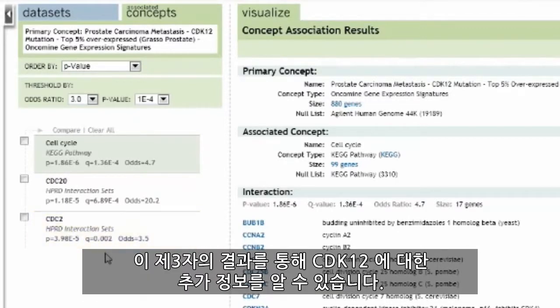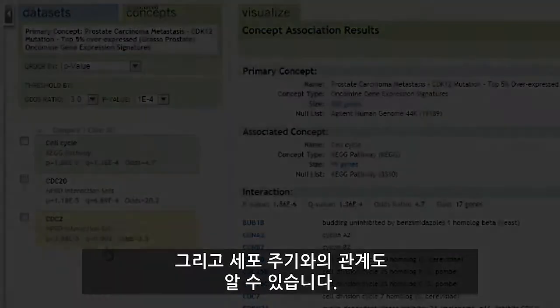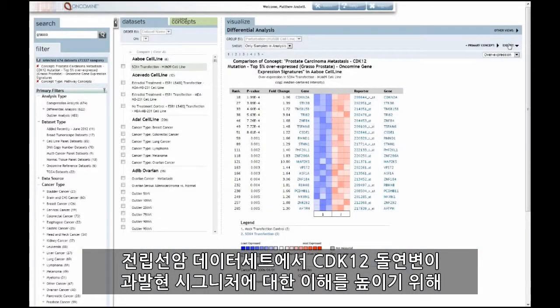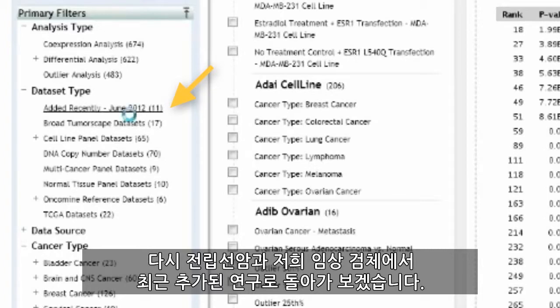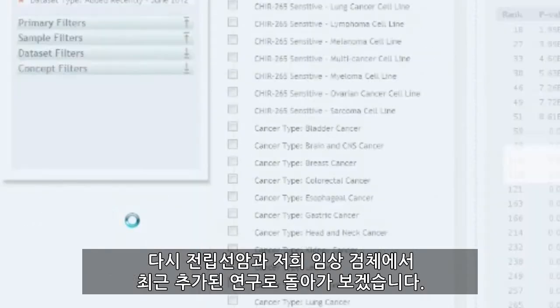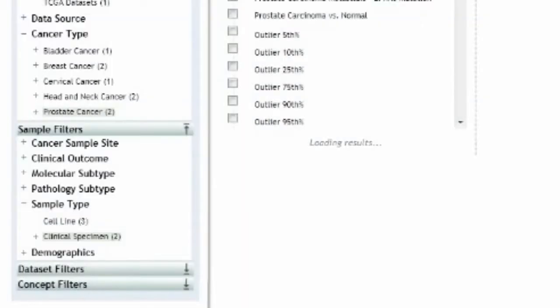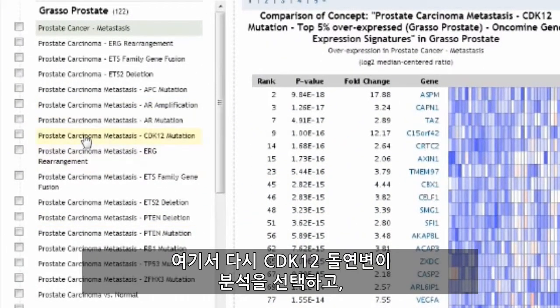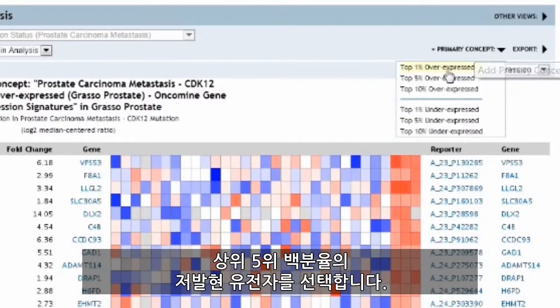These third-party results give us more information about the CDK12 signature and its relationship to cell cycle. For a better understanding of the CDK12 mutation overexpression signature in the prostate cancer dataset, we can return again to the studies recently added in prostate cancer that were clinical specimens. Here again, we can select the CDK12 mutation analysis and select our primary concept for the top 5% underexpressed genes in the CDK12 mutation signature.